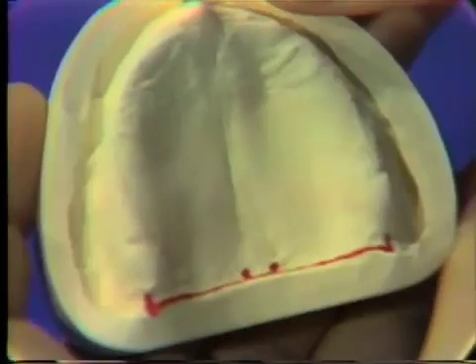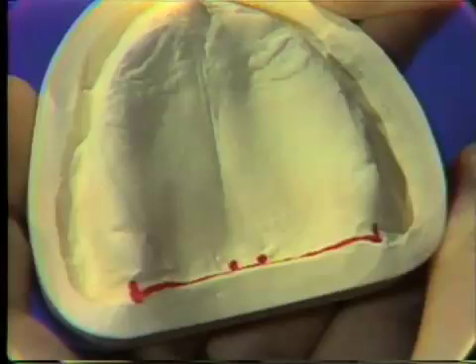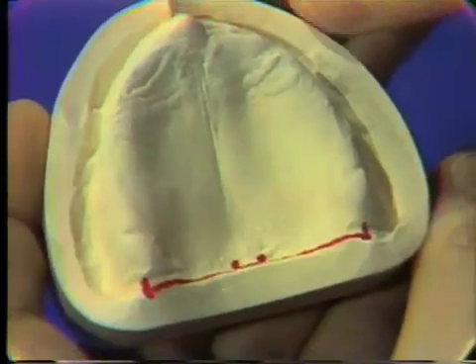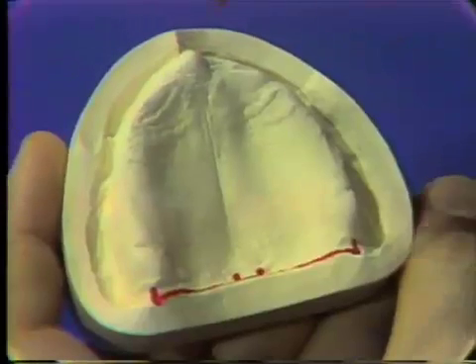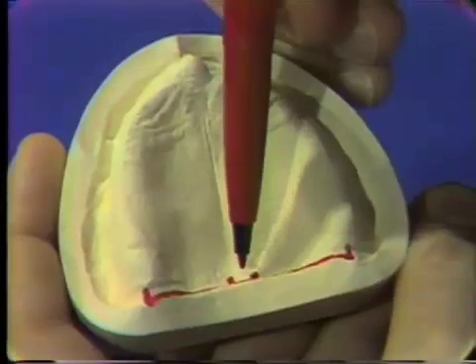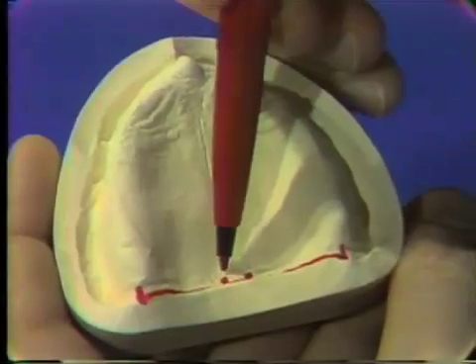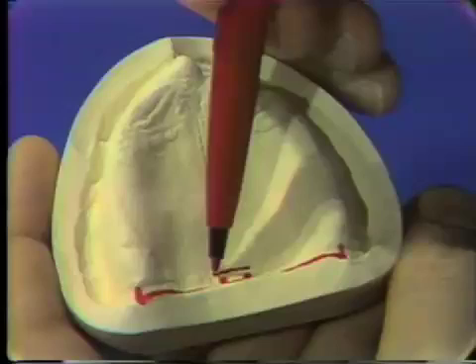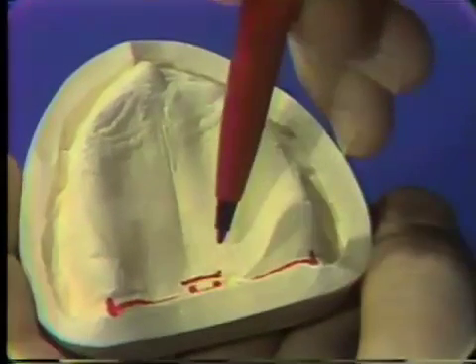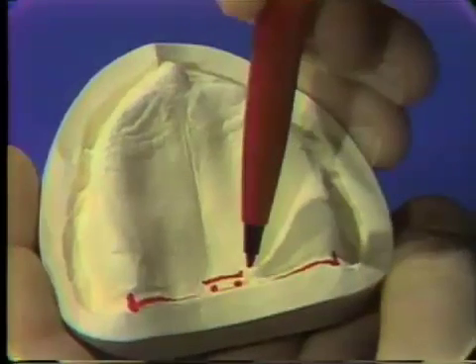Notice that it goes to the hamular notch area, but it does not go through the notch. The anterior portion of the posterior palatal seal in the midline should be at least three or four millimeters anterior to the posterior limit, and then should blend down to the posterior border laterally.